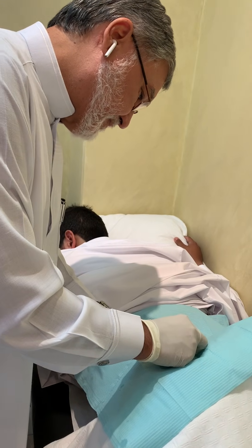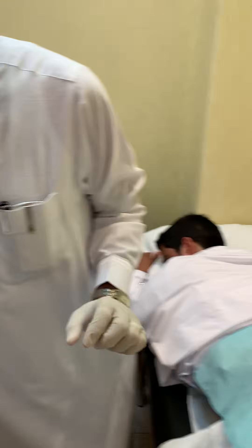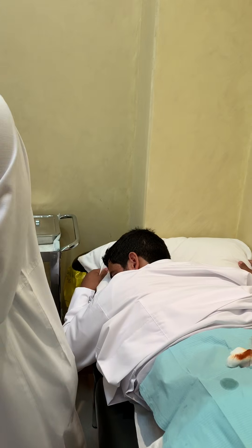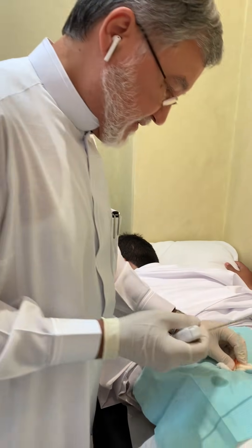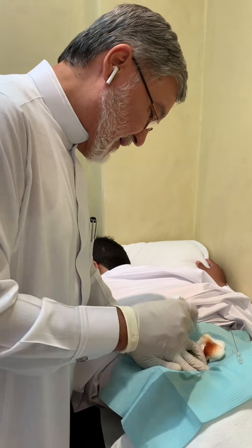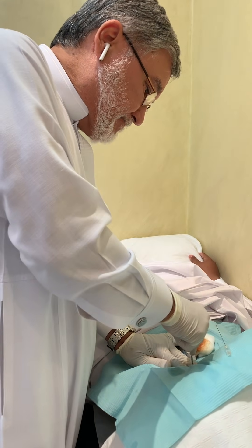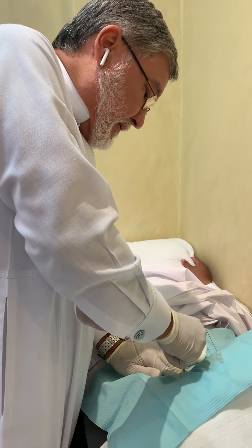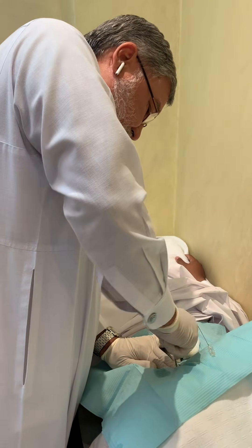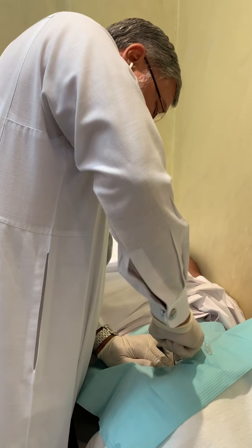We'll make a small incision where we did the dermal anesthesia — he will not feel it. We did a small incision. I'm leaving the spinal needle intentionally so as not to lose the area. This is the bone marrow biopsy needle — it looks a little bit brutal; however, the procedure has almost no complications.